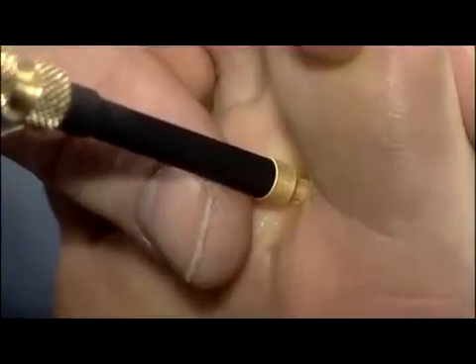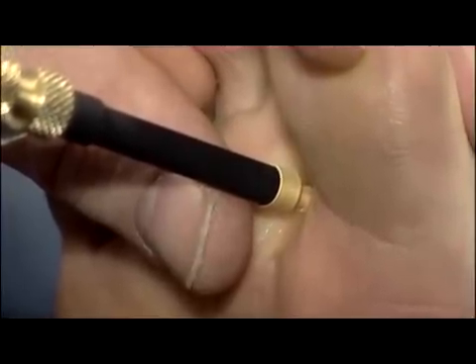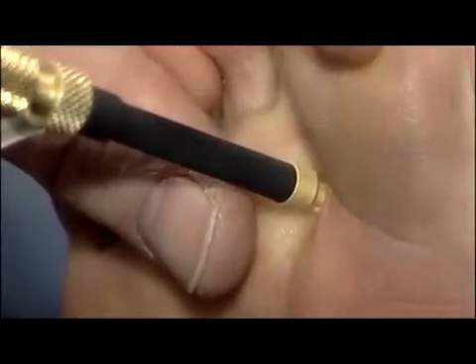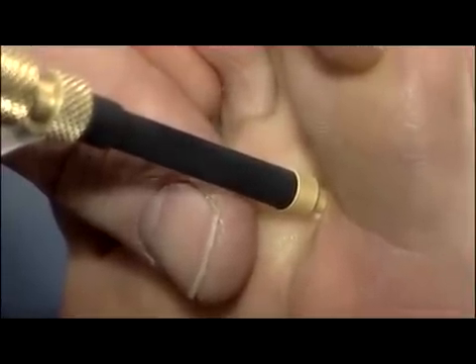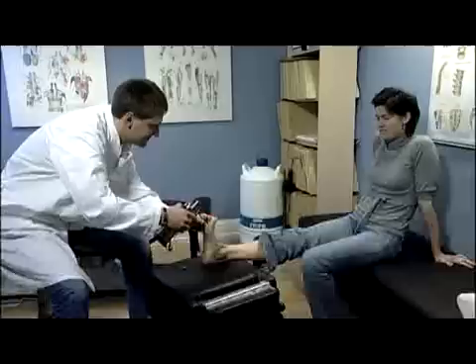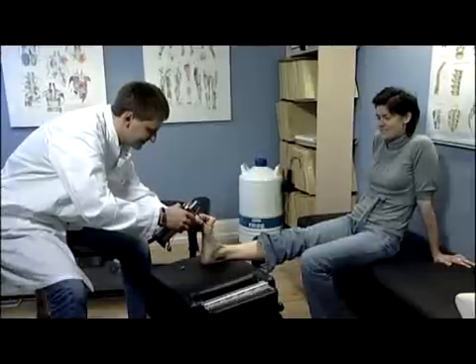After a few seconds the probe adheres to the skin, ensuring optimal skin contact and heat transfer. Keep freezing until a one millimeter frozen halo is seen around the probe. Then release the trigger and the probe will come off in a few seconds.